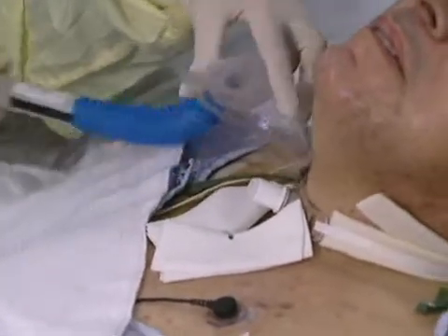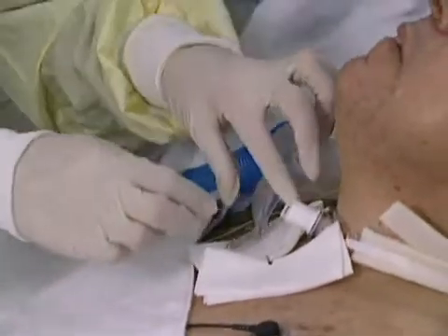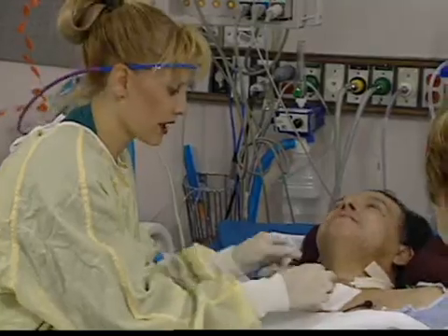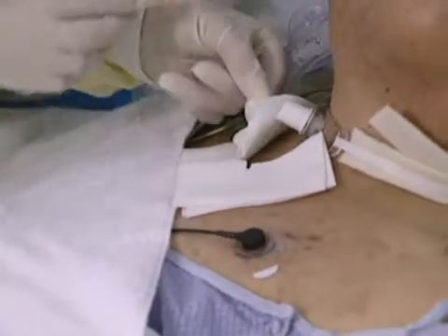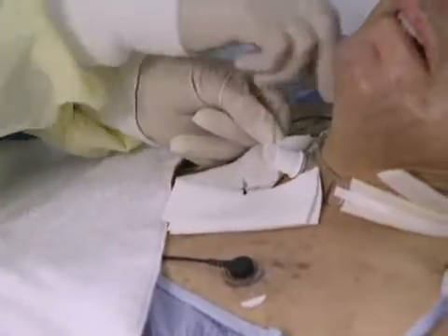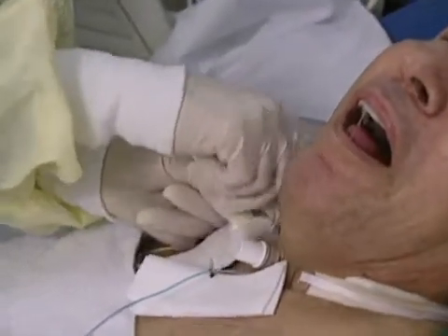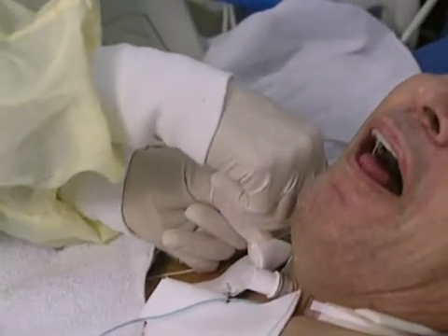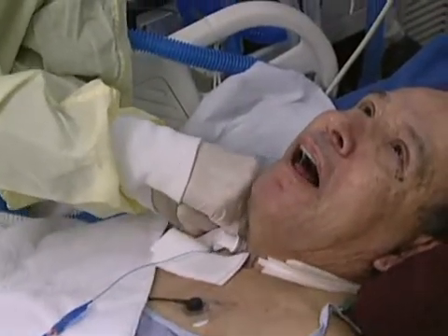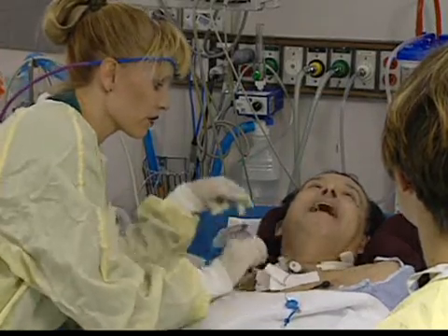Okay, we'll just place the trach collar, maybe angle it in a position where he can still get some of the humidity and oxygen. If you can take the tip, the inner tip, and kind of dog ear it like this. And Mr. Gonzalez, can you turn your head to your left, please? Thank you. And make sure you get all the tubings out of the way. The trach ties should not be too tight, but you want to be able to fit a finger beneath there.